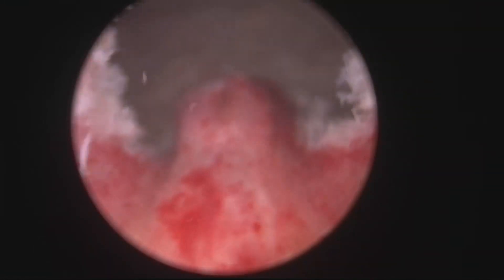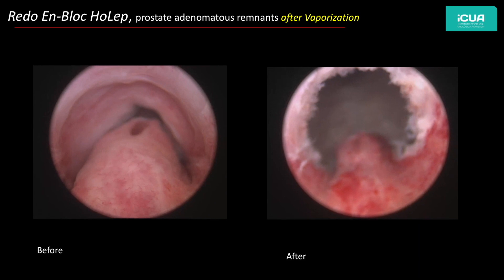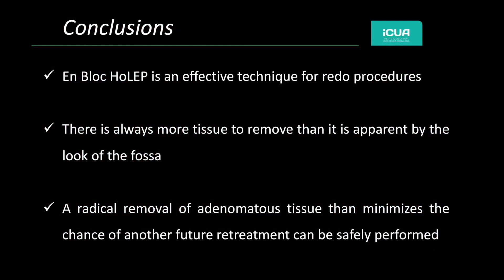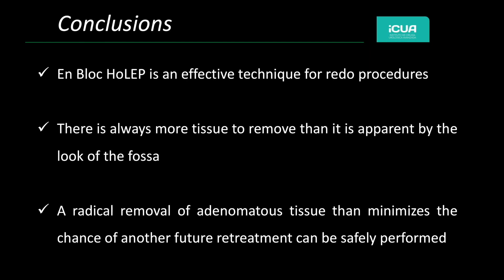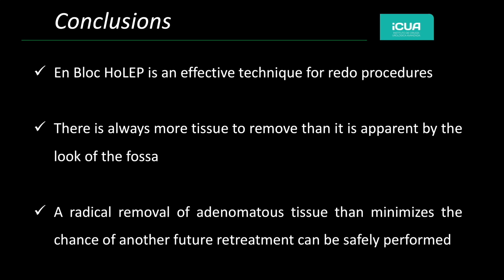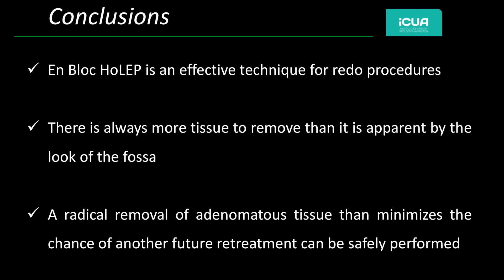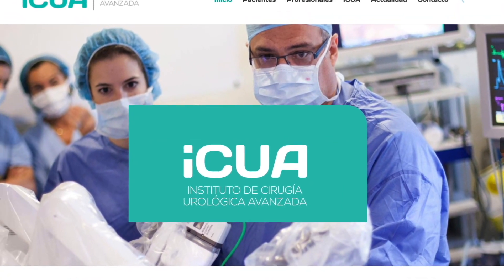This is the last case. Again, excellent preservation of the sphincter and the sphincter's mucosa. In conclusion, en bloc HOLEP is effective for redo procedures. There is always more tissue to remove than is apparent by the look of the fossa, and a radical removal of adenomatous tissue will reduce the chance of re-treatment in the future.